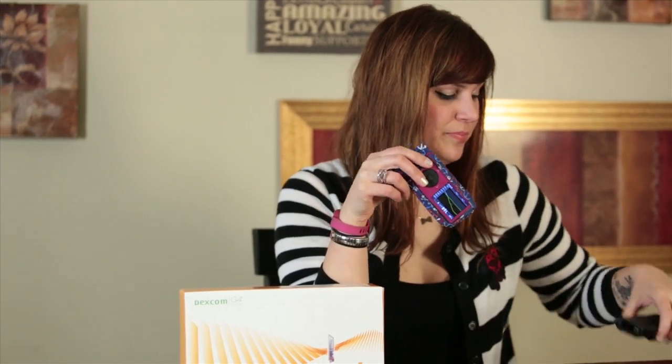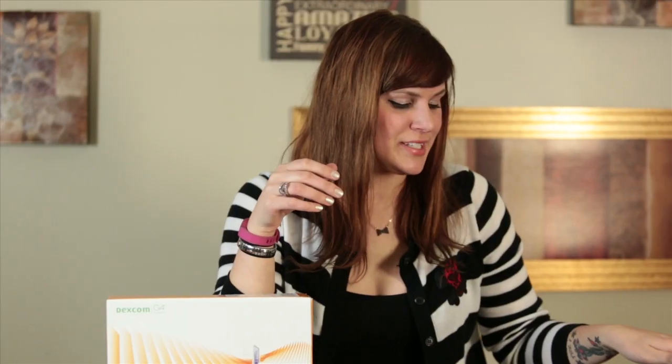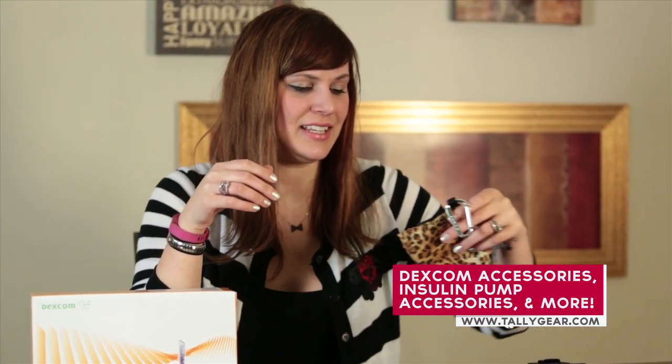I'm going to be doing a change today on my Dexcom — I have it in this arm, you can see the little bump sticking up there — and I'm going to be changing it over to my right arm. In my opinion, it's pretty close to painless if you do it the right way, not to say it's not going to pinch a little bit. We're going to talk about how to insert it, exactly what it does, how it works, and some fun accessories you can get for it. This is the case that comes with the Dexcom — boring — and the clip on it is kind of awkward. Maybe it works for some people, but for me this just wasn't cutting it.